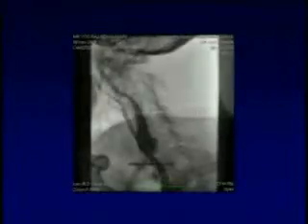A case on endovascular repair of a thrombus-laden pseudoaneurysm of the carotid artery. This is the story of a 78-year-old gentleman who had recurrent TIA in the territory of the middle cerebral artery. He had bypass surgery in the past, and had a left carotid endarterectomy 6 years prior to the admission. He's diabetic, hypertensive, and has a very severe chronic obstructive pulmonary disease. So it's high risk for a repeat surgery.